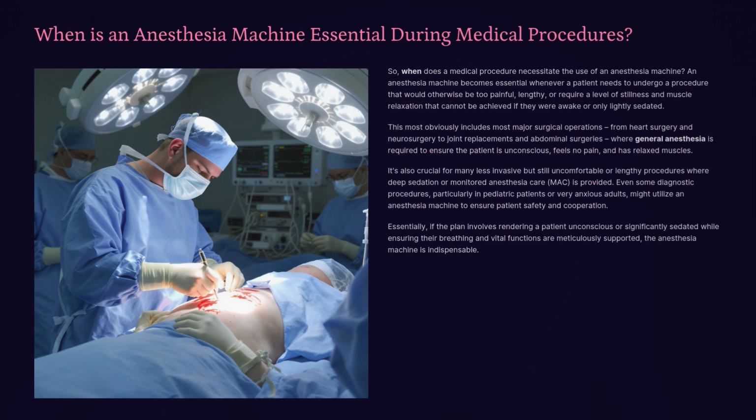It's also crucial for many less invasive but still uncomfortable or lengthy procedures where deep sedation or monitored anesthesia care (MAC) is provided. Even some diagnostic procedures, particularly in pediatric patients or very anxious adults, might utilize an anesthesia machine to ensure patient safety and cooperation. Essentially, if the plan involves rendering a patient unconscious or significantly sedated while ensuring their breathing and vital functions are meticulously supported, the anesthesia machine is indispensable.